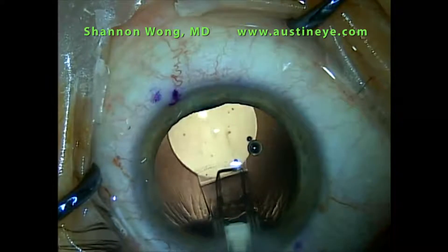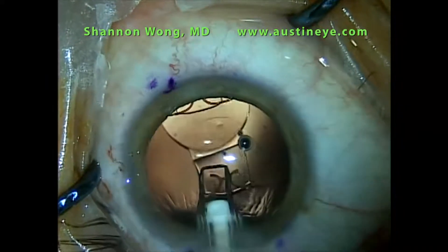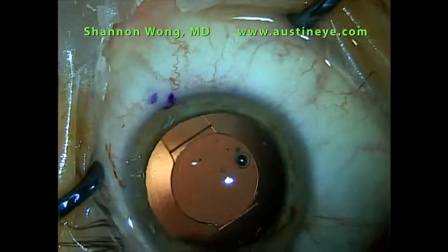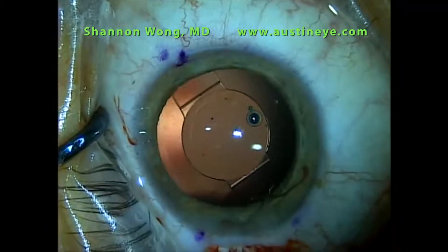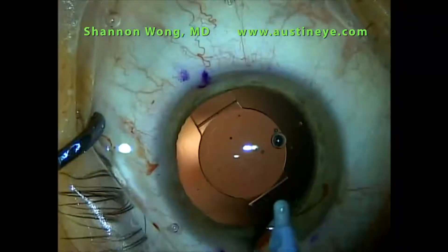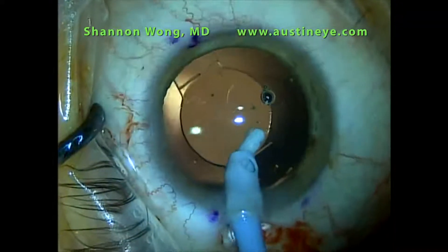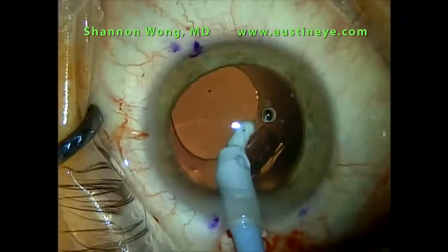We insert the lens. Usually, I'm not able to put all four haptics underneath the anterior capsule leaflets. Usually, in my technique, the trailing haptics remain in the anterior chamber, anterior to the iris plane, but that's not a problem. I use a silicone tip IA — this silicone tip is made by MST Microsurgical. I just push the lens forward and let one of the remaining haptics go underneath the bag.